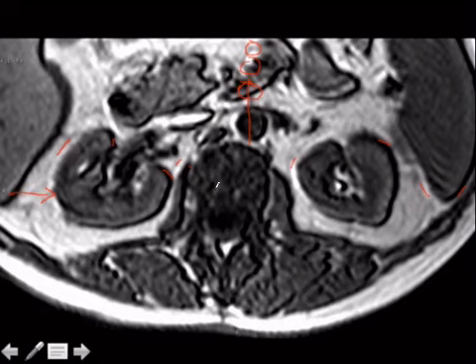If you're imaging the breast, they tend to flip it. The reason is you don't want stuff pulsating, either from respiration or from the aorta or the heart, which is right behind the breast, into the field of view so that you can't tell what's going on. Because you really need to be able to avoid overcalling stuff and performing unnecessary biopsies. So you want to be able to really see those things well when you do breast MR. So they flip it. So this would be the phase encoding direction in breast.